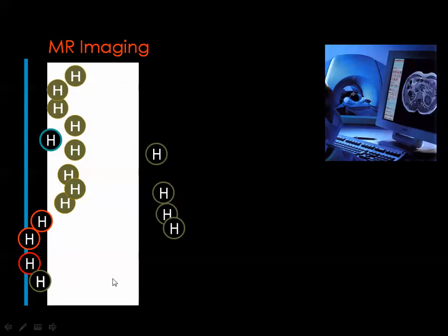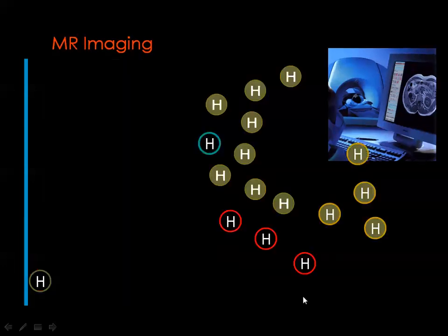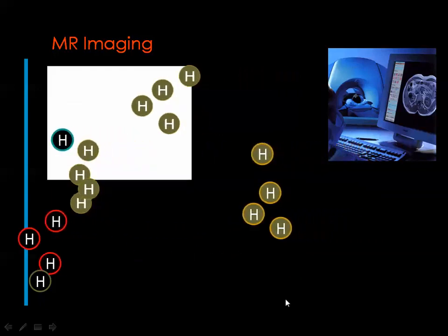Okay, and you have now one hydrogen type that has been imaged and 3 types that are not imaged: the non-mobile hydrogen, the hydrogen which is very fast, and the hydrogen which is slow. Then in order to differentiate the black appearance of these hydrogen from this, we will increase the imaging time, and this is represented by the broad white band.